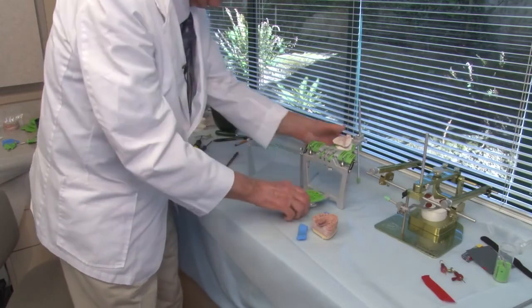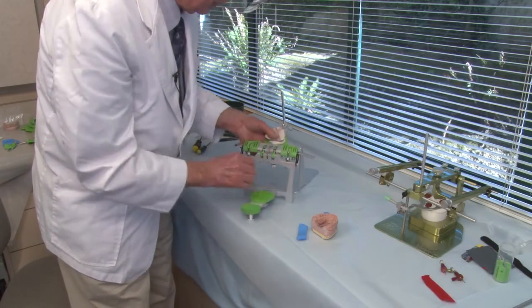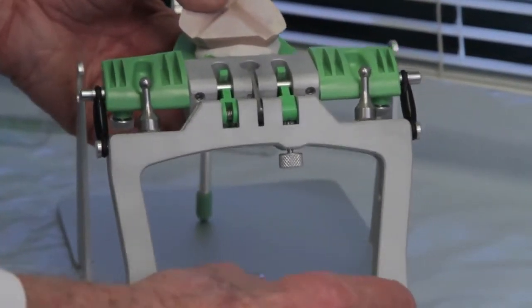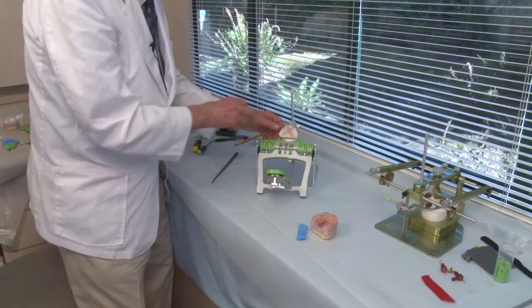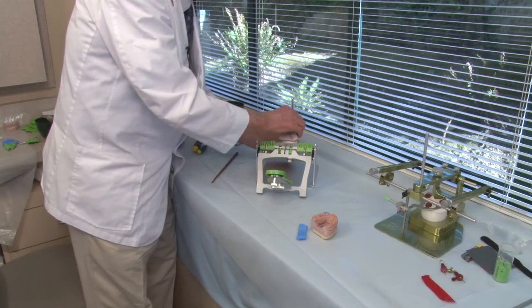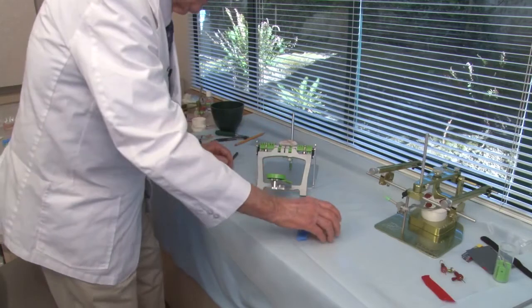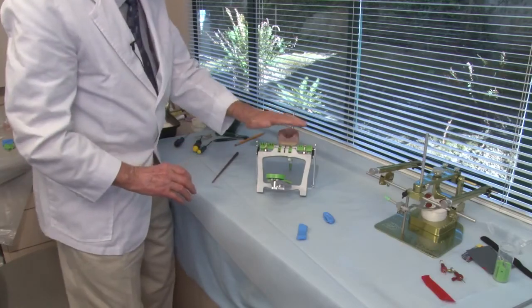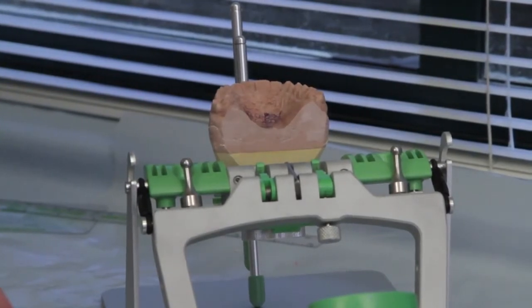And you remember the mounting stand now, we're going to use the extensions here that hold the side shift activators in. The upper part of the articulator goes over the mounting stand, the base of the mounting stand, and we slip it in like that. Now I want to adjust the position of the upper model so that when I add plaster it won't fall off. So I have to change the pin, the posterior pin, and in a moment when I put the lower model on, I want the base of the lower model parallel to the floor. Then when I add plaster to it, the plaster will not fall off.